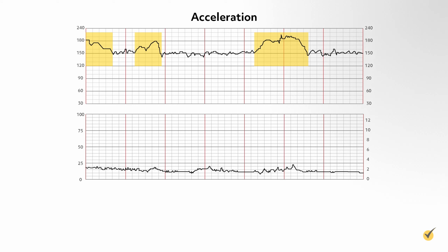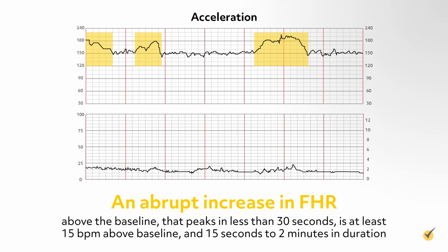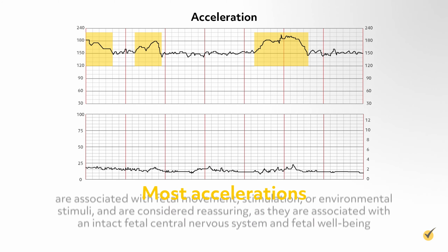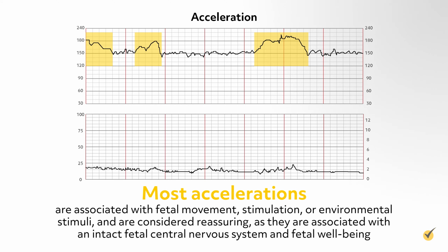An acceleration is defined as an abrupt increase in fetal heart rate above the baseline that peaks in less than 30 seconds, is at least 15 beats per minute above baseline, and 15 seconds to 2 minutes in duration. A prolonged acceleration lasts from 2 to 10 minutes in duration. Most accelerations are associated with fetal movement, stimulation, or environmental stimuli, and are considered reassuring as they are associated with an intact fetal central nervous system and fetal well-being.